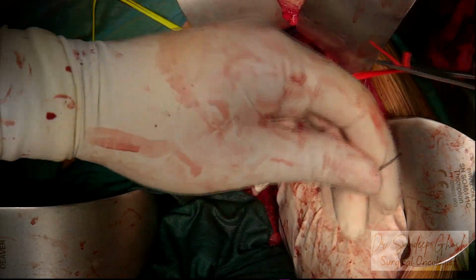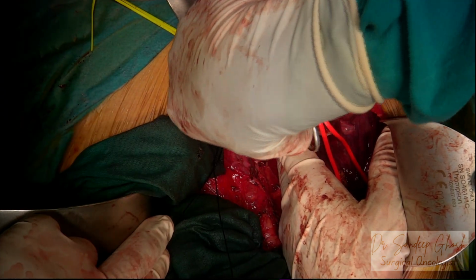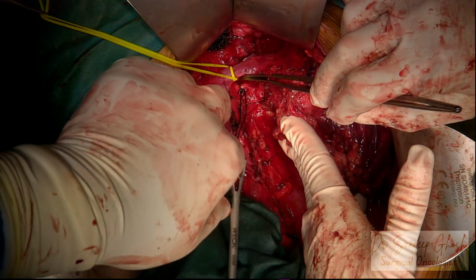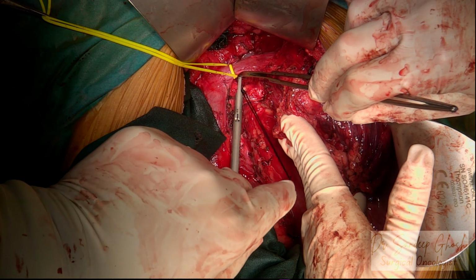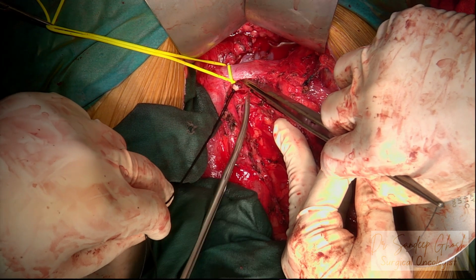Now the renal artery will be tied first, as is usually the case in all nephrectomies. The artery first approach should be followed. We are also putting a Hem-o-lok for extra security. The renal artery being cut here.